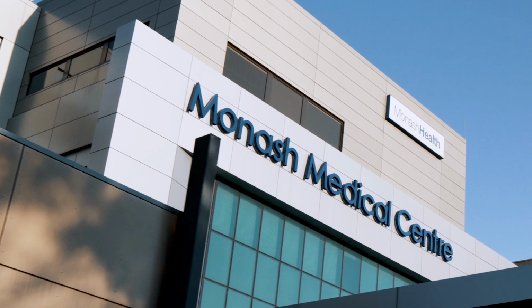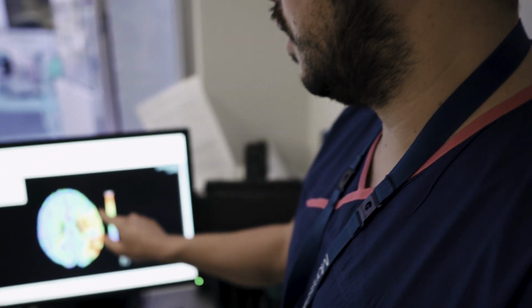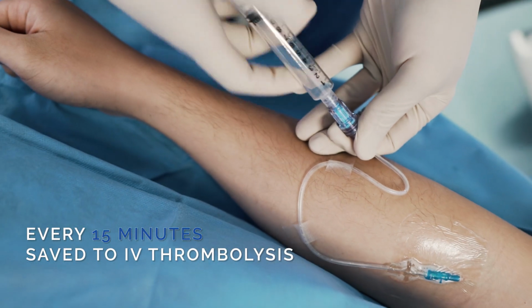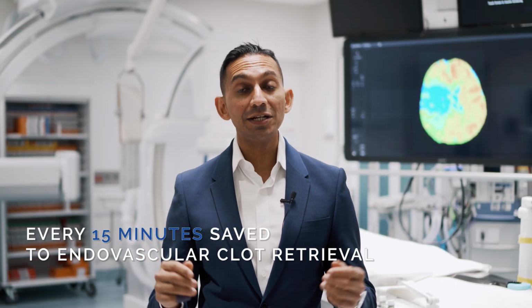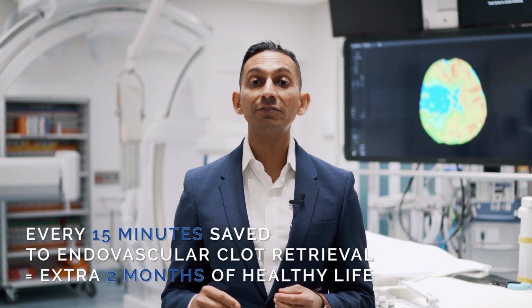Code stroke is a clinical pathway designed to facilitate rapid assessment and treatment of stroke patients arriving to Monash Health. Early diagnosis and reperfusion treatment saves lives and reduces disability. For every 15 minutes that we save to intravenous thrombolysis, the patient gains an extra 1 month of healthy life. For every 15 minutes that we save to endovascular clot retrieval, the patient gains an extra 2 months of healthy life. The purpose of the code stroke procedure is to rapidly identify patients who are eligible for reperfusion treatment.